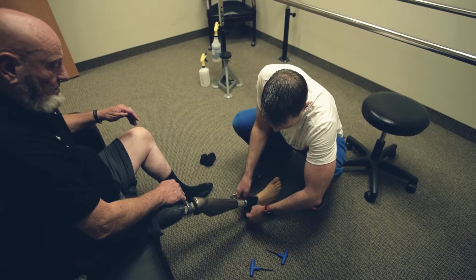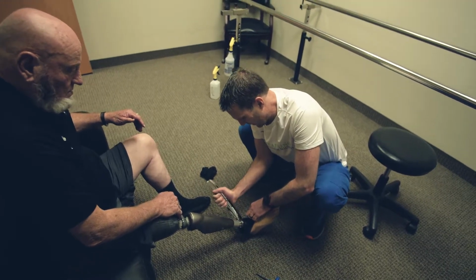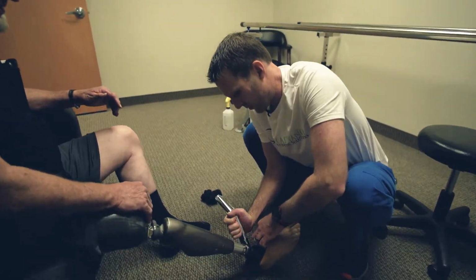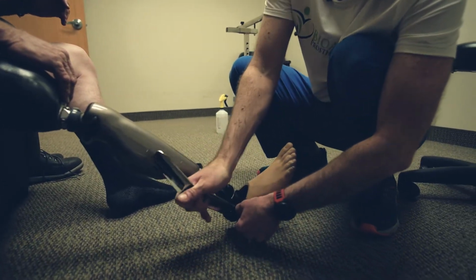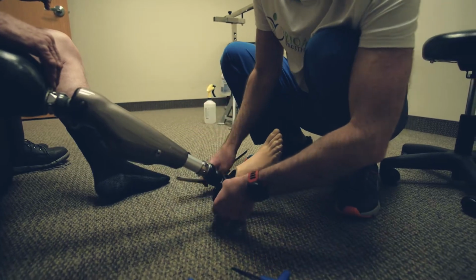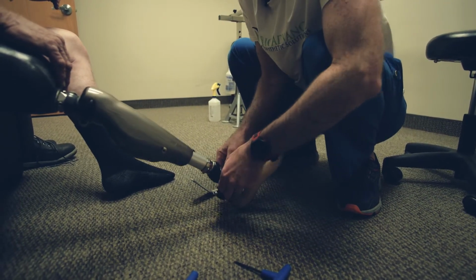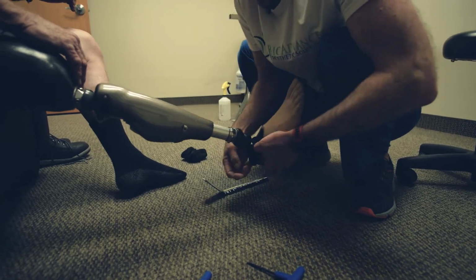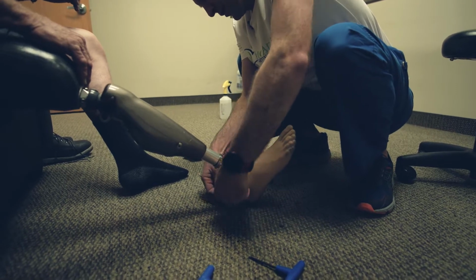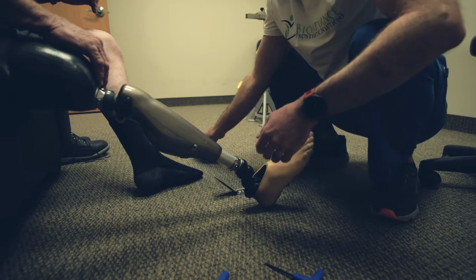Okay, so I'll be aware that if you can't get it, just know that next time you come in, your shoes are going to be eaten up a little bit. But I know you're a long ways away, so you don't come out this way that often. And then you're just going to push the foot shell or the sock down in there, but just make sure it's up high enough to give you a little bit of protection around the foot shell, because it will squeak if you don't.